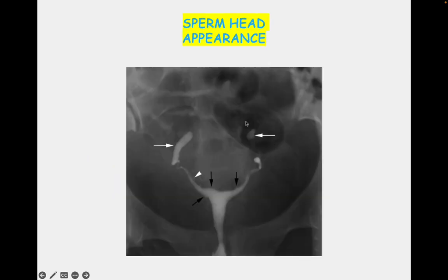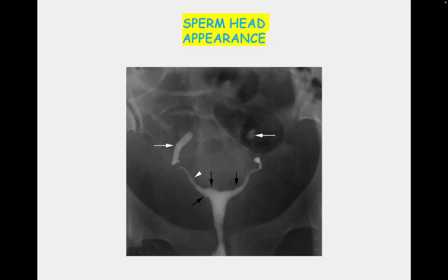Another picture seen in HSG is the sperm head appearance. The sperm head appearance results from vertically oriented, fixed tubes with ampullary dilation — the ampulla gets dilated, the tubes are vertically oriented, and they are fixed because of peritubal adhesions, which restrict the normal motility of the tubes.